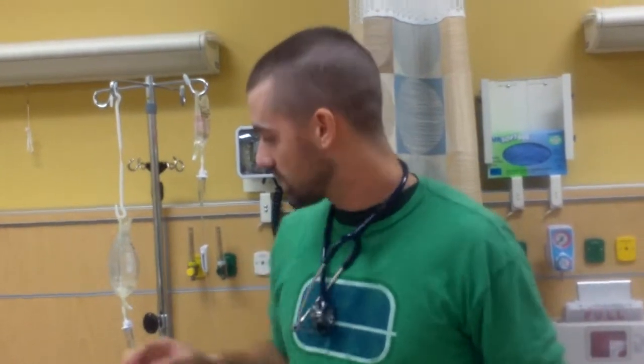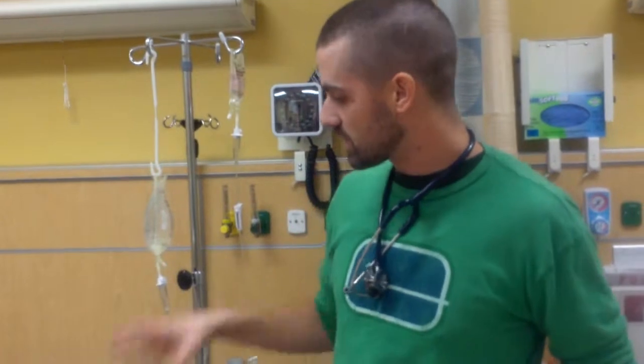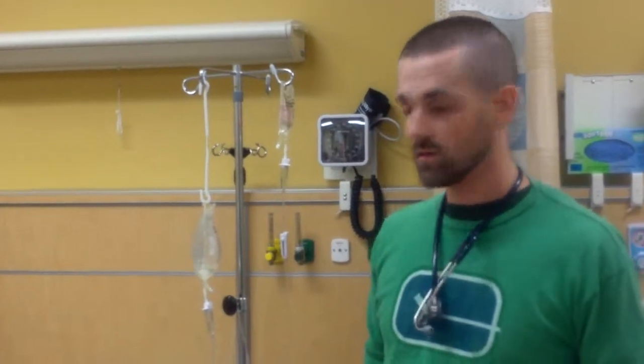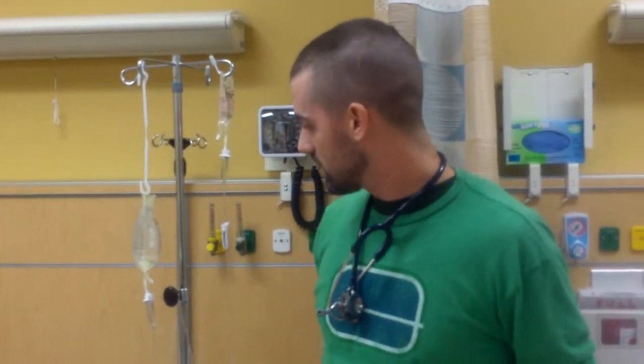I would document that. I would document how well he took that. And I would also make sure my patient is comfortable. Anything else that I do for him, he has his call light well within reach. I can take the curtain back so it's a little more open for him. And then I would be back and assess my patient at that time. And that's my video.